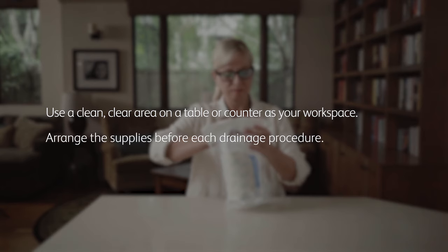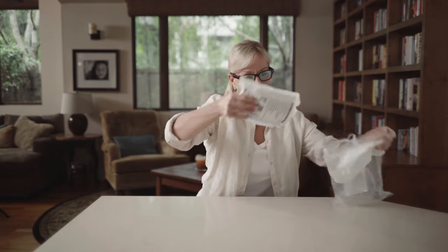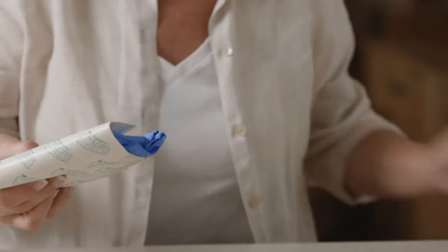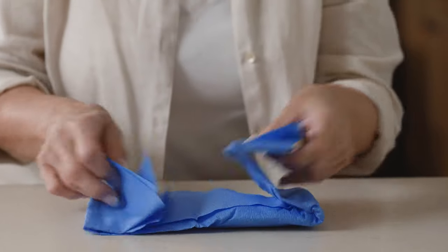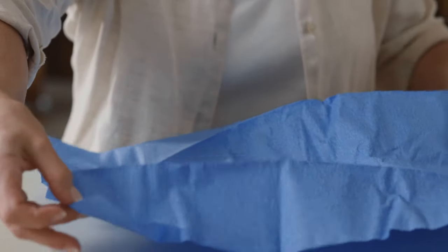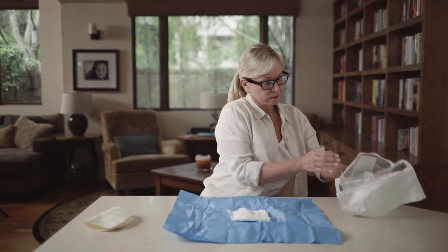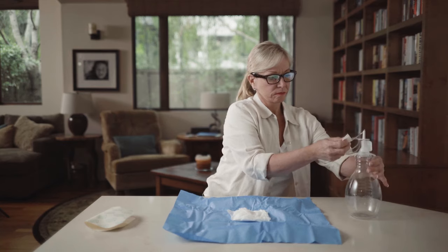Arrange all of the supplies prior to beginning each drainage procedure. First, open the drainage kit bag and remove the procedure pack. Next, open the procedure pack and remove the blue wrapped bundle and adhesive dressing. Set the adhesive dressing aside and place the blue bundle on your workspace with the folded side up. Carefully unfold the blue wrapping by pulling on the outer edges of the bundle. The items inside are sterile, so avoid touching them. The inside of the blue wrapping provides a clean work area. Remove the drainage bottle and connected drainage line from the bag and set the bottle on the table next to the blue wrapping.